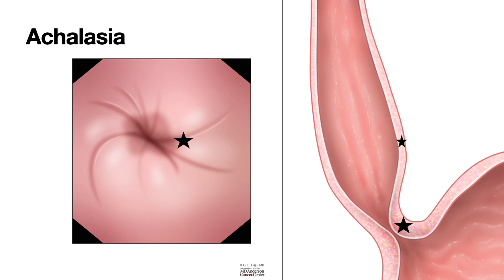There are other ways to manage this problem, that is disrupting the muscle with the help of a surgeon who goes with either a thoracoscope or a laparoscope and cuts the esophageal muscle, or an advanced endoscopist tunnels into the esophageal submucosa, goes down to the lower esophageal sphincter, and then cuts the muscle and then comes out and closes the tunnel. That is known as peroral endoscopic myotomy or POEM. So today we will learn about pneumatic balloon dilation to disrupt the lower esophageal sphincter.